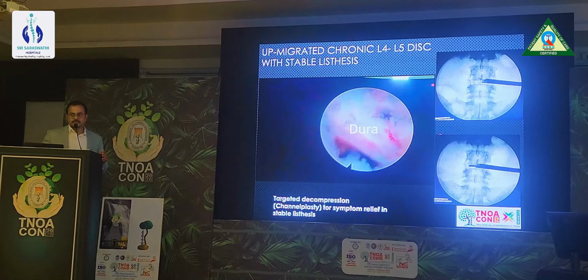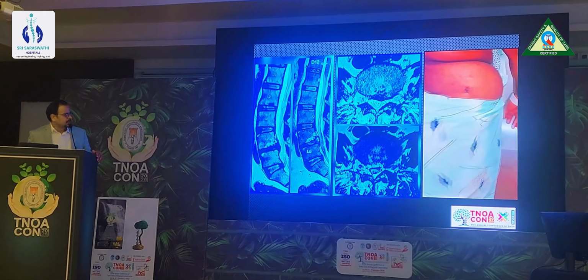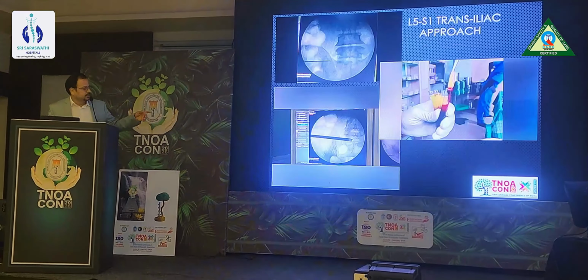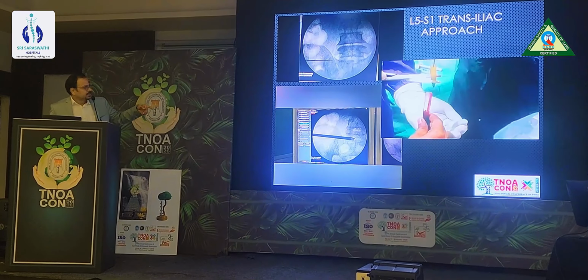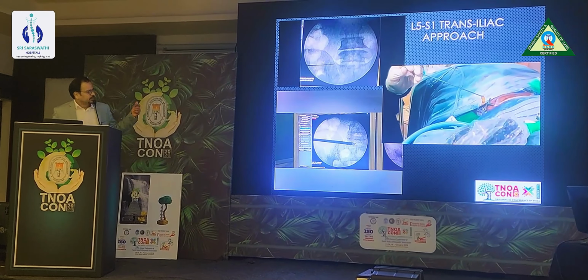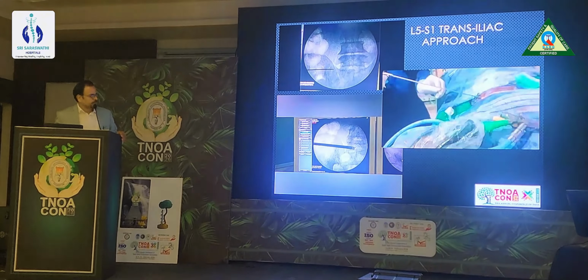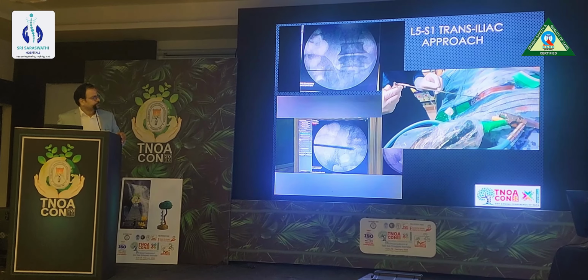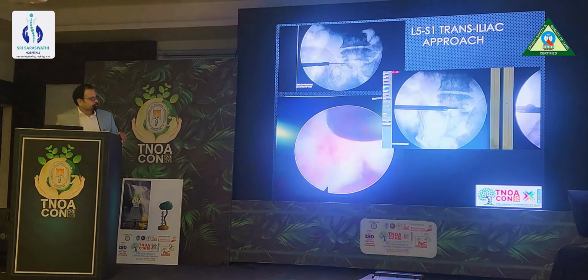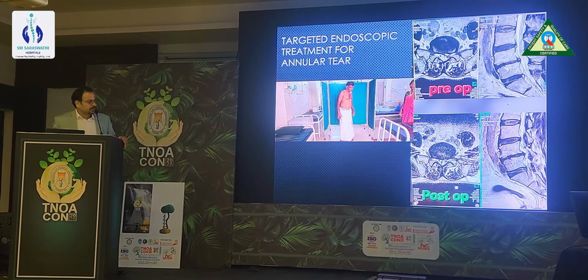So the same philosophy is applied for all, even for discitis as well as annular tear. We can address the annular tear. This is a case of L5-S1 pathology, where we sealed the annular leak using a biological annular plug. The patient was mobilized the next day. You can see the post-op MRI, there is a complete biological sealing of the annular tear.